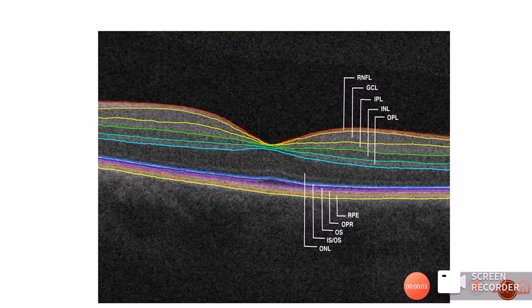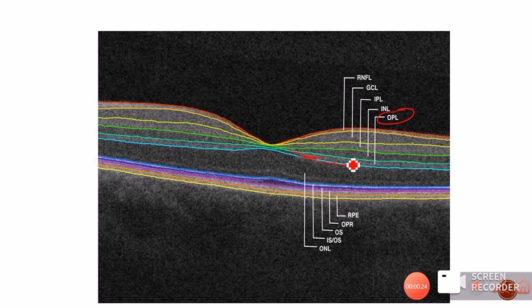If you are not familiar with the anatomy of the retina, you can visit my video on the layers of the retina. As you can see on this OCT representing the layers of the retina, the outer plexiform layer is represented between the blue line and the green line, and this is the location where we find hard exudates.